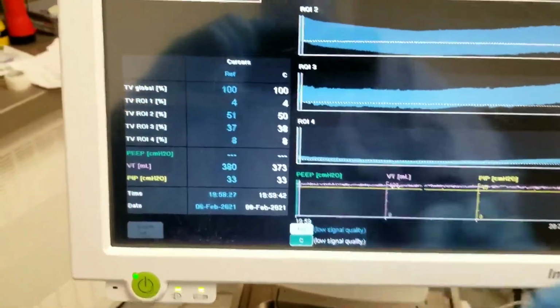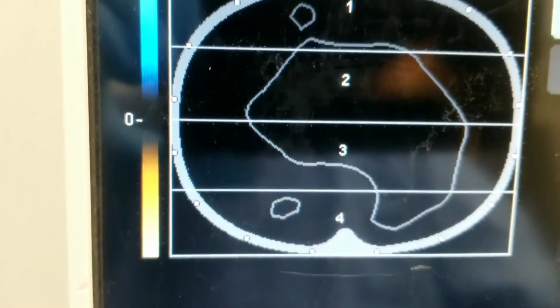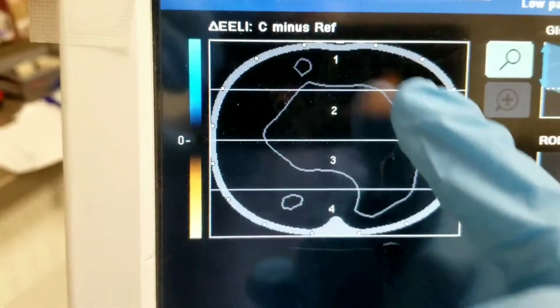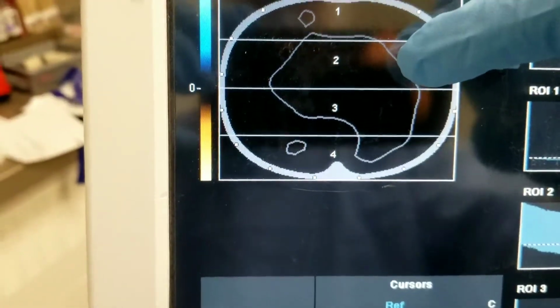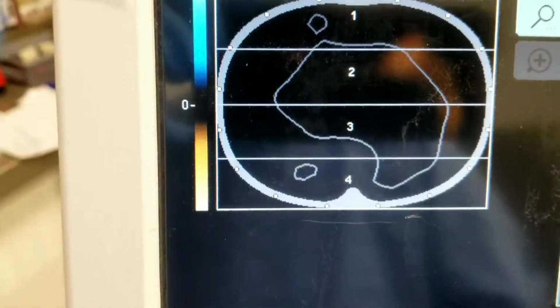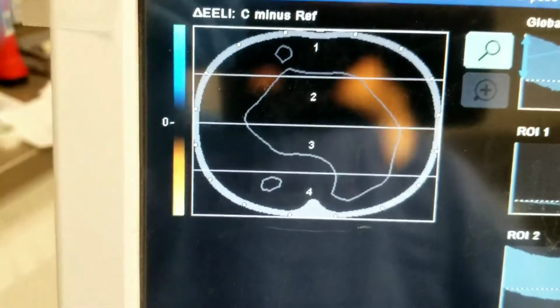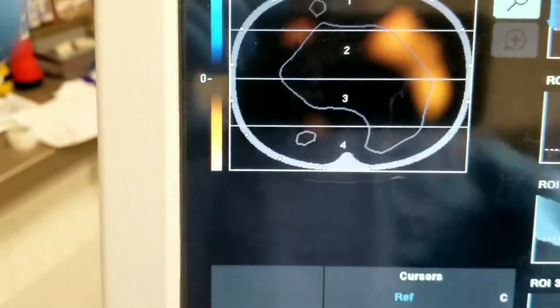This was at 20, I'm going 30 minutes now back to where we are presently. And when we first changed, initially, before things started looking blue, we started with a reduction in the Phigh. We started seeing actually a loss in distribution at these ventral areas. What's that mean? If I'm losing here, it means that it's going probably in the correct area. So it's good actually when you lose orange at the top, because you don't really want that tidal volume always going up to the ventral and mid-ventral areas. So we're losing a lot here.